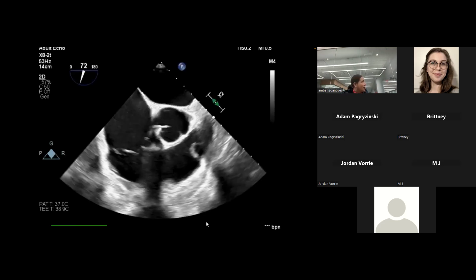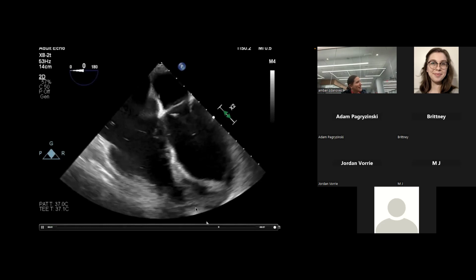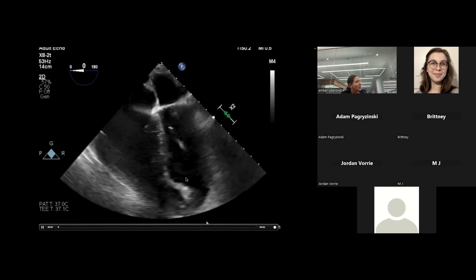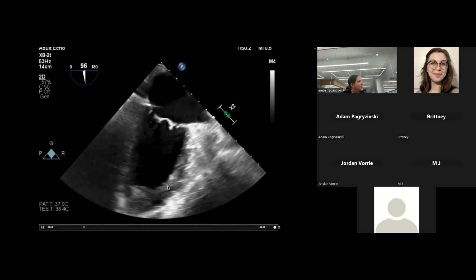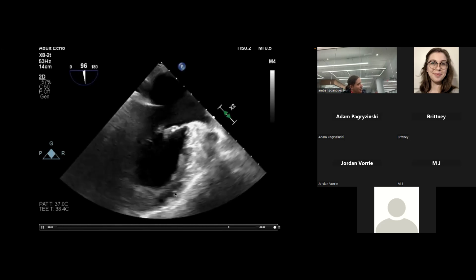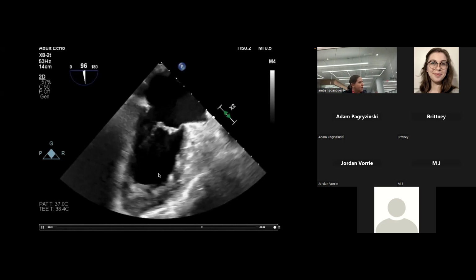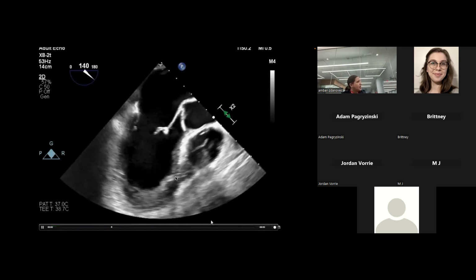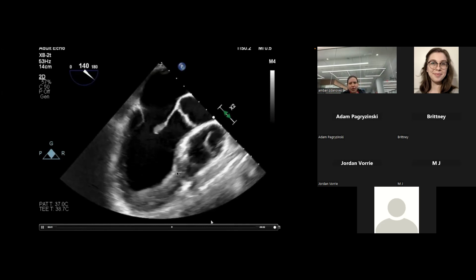So one thing I did not bring up, because I actually missed it the first time I took these pictures: thrombus. What do we think this is right here? Yeah. So that's actually a pretty nicely laminar LV thrombus right there. And I was so shocked by his terrible EF, I completely missed it on my scan. Luckily they had somewhat seen it on the CTPE and we got a TTE, but this right here is going to be all thrombus. So a lot of times we think of thrombus as something that's waving or pokes out and doesn't mesh with the myocardial borders, but that right there is just thrombus. You can see it probably here too, which limits a lot of your options for circulatory support.